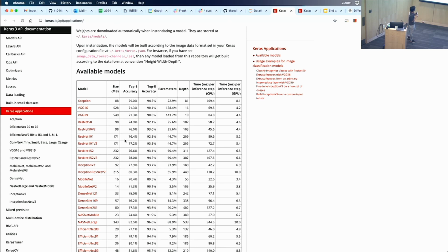Okay, so you can see there are performance numbers right here. If you use a different base model, you will get different performance. But this is the performance for a 1,000 object recognition task, like a dog, cat. And so you can see they have different performance.